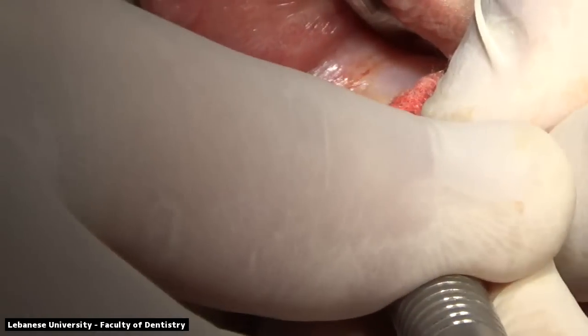We have a thick tissue biotype in this case, so it's a bit hard to remove this excised tissue. We're going back with the curette and making sure that we have a clean cut.